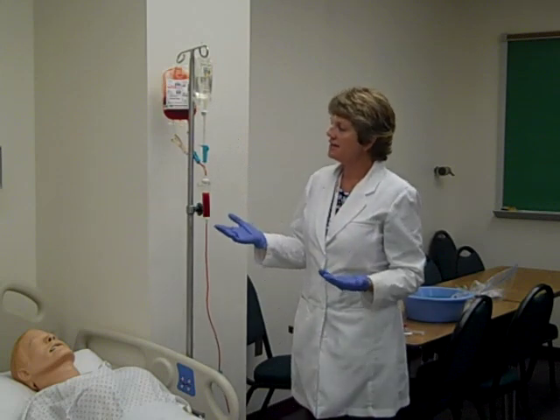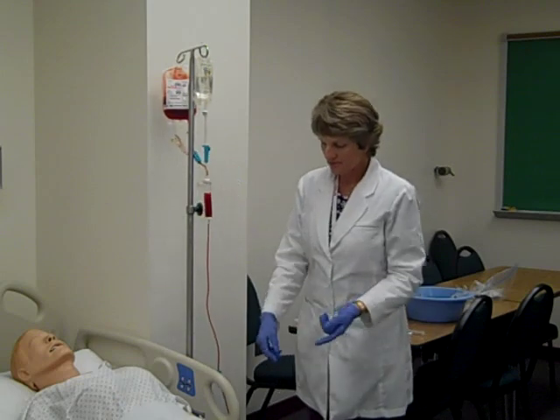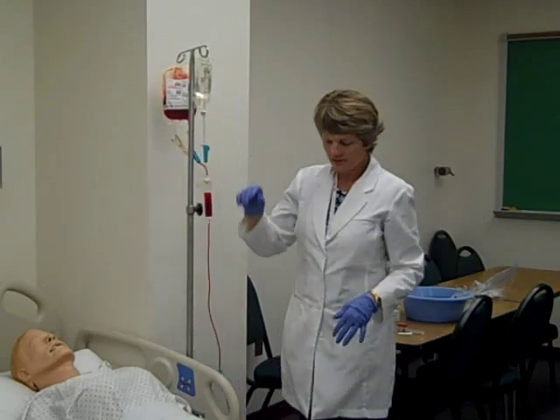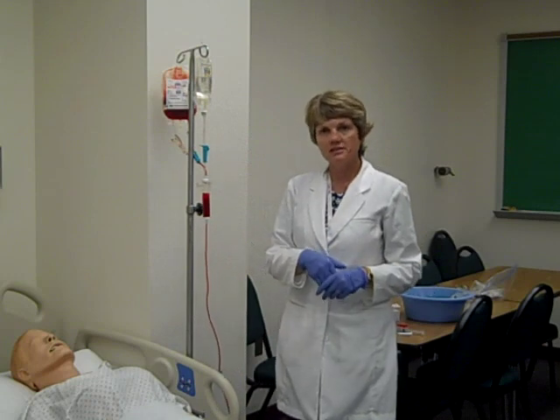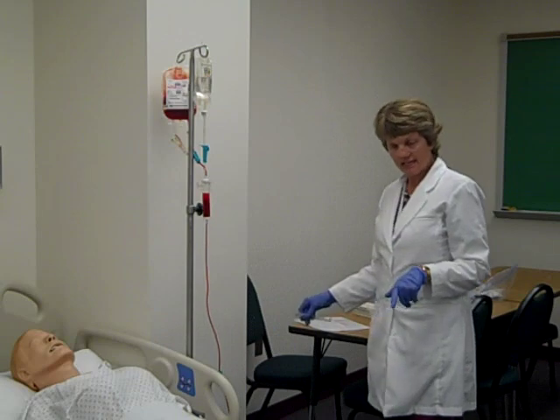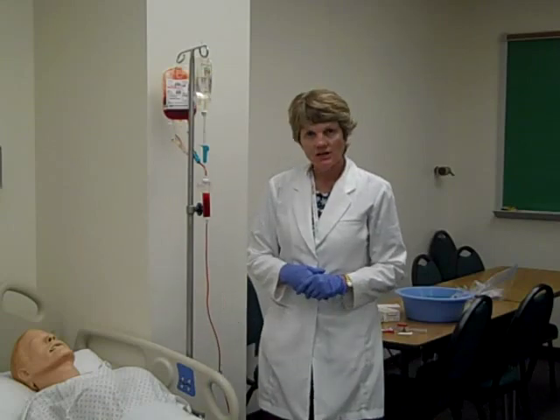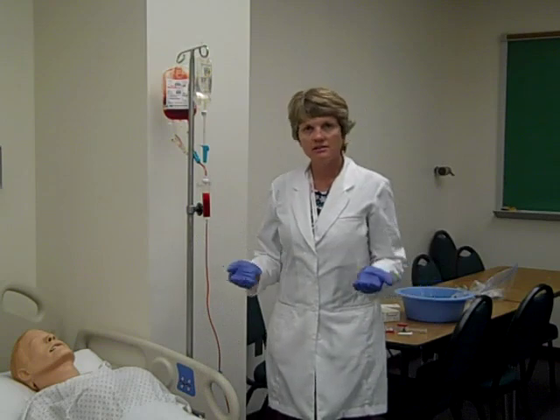When it's all done and it's all flushed, what we can do is close our clamps, unhook it from the patient, and put all of these, the blood tubing, the blood bag, the normal saline bag, all in a red biohazard bag, take it to the dirty utility room and discard it. Go ahead and flush the saline lock again, so that it's patent, there's no blood residue in that, and lock it off, and continue to monitor the patient and continue to monitor labs.